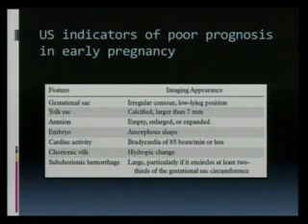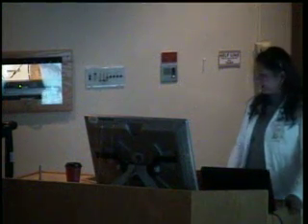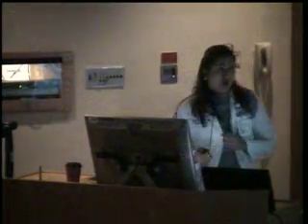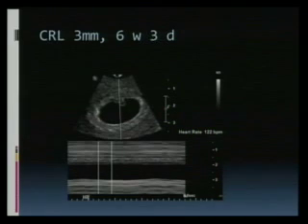I was going to ask you if you could explain how to measure on the M mode. Yes. Very, very important to know is that all machines that calculate the M mode are not the same. Different vendors have different things.